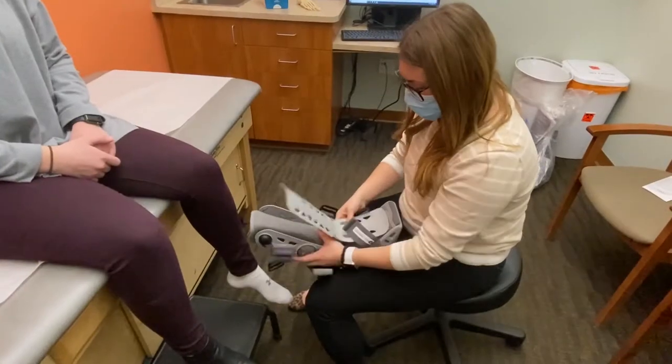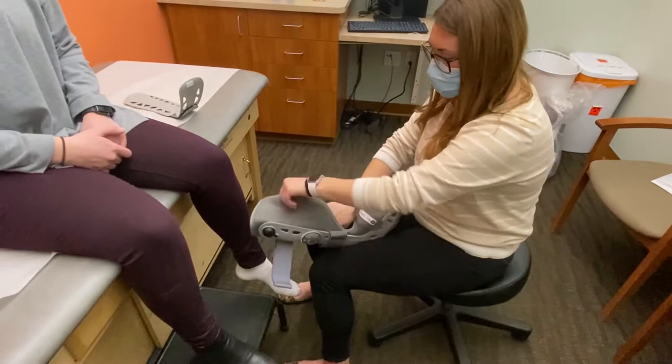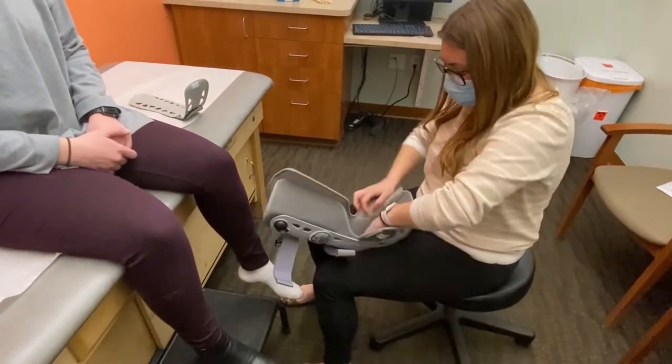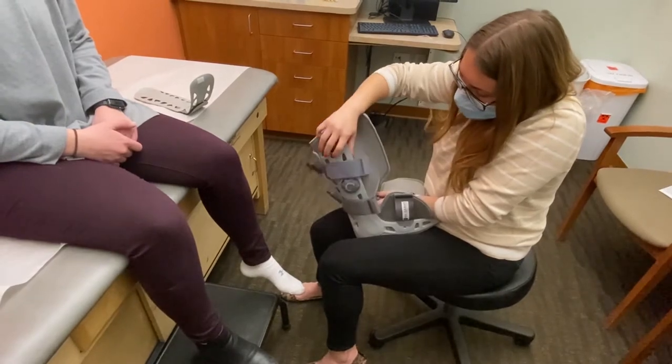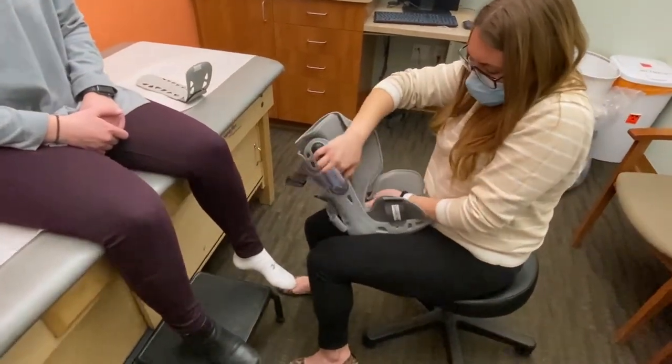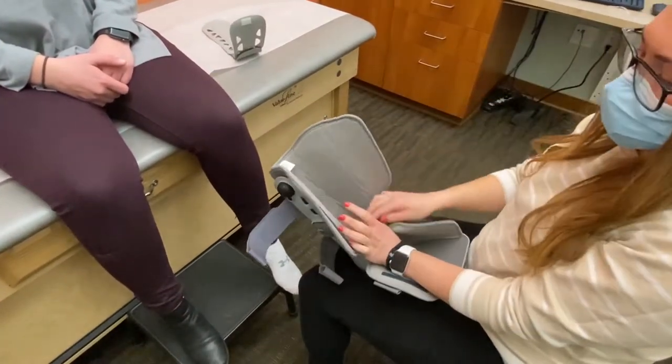First, you'll start off by taking off the top cage. It's always a good idea to make sure that all the air is deflated before you go to put your foot back into the boot. I usually like to go through chambers one and two and press the little deflate button just in case.